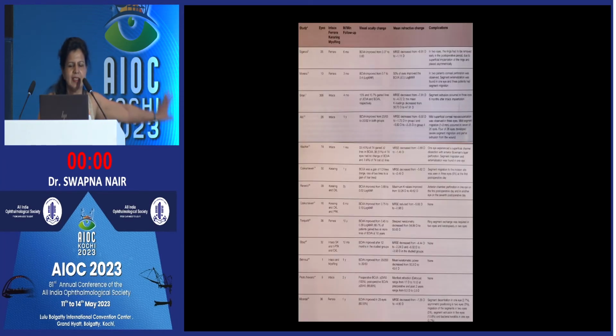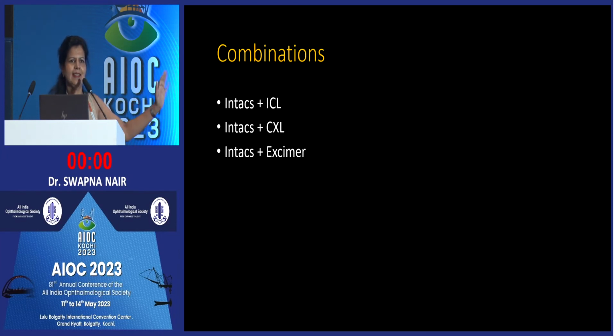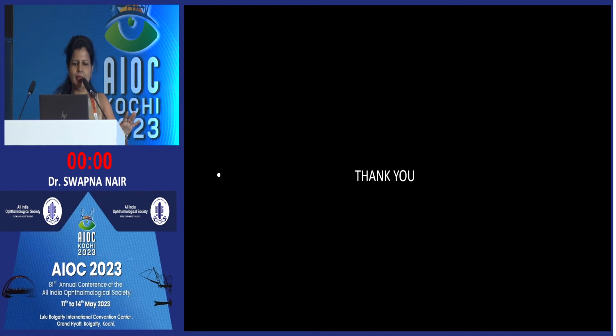These are the various studies, I know it's a busy slide, that have tested the efficacy and the safety of the segments. And these are the multiple combinations that can be used along with these segments to provide correction of the basic condition as well as visual rehabilitation.